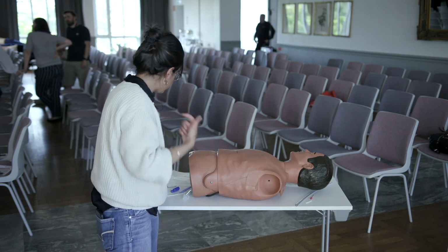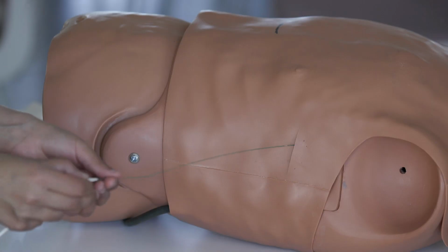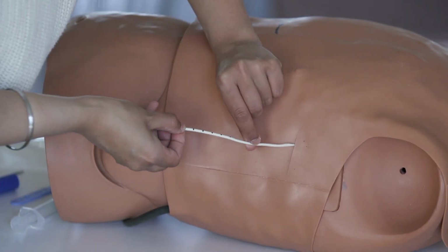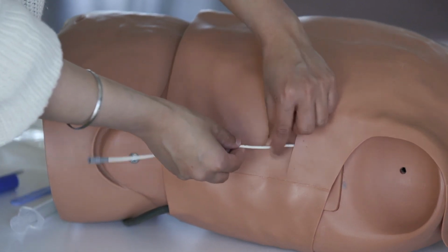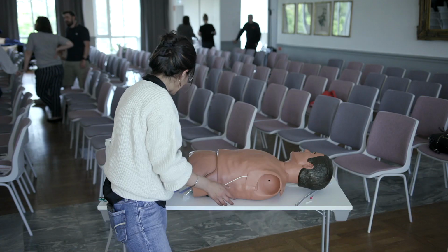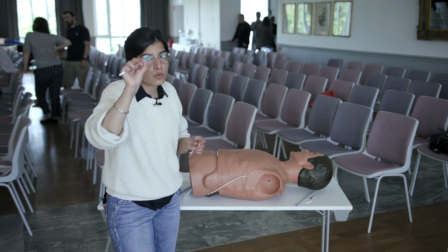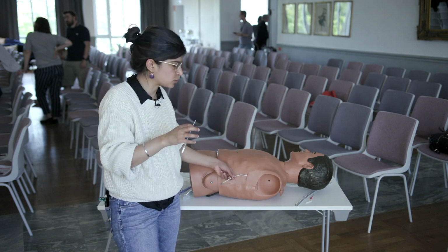Okay, so you've dilated enough, you come out, and because this is just flimsy enough, it just feeds right onto the end, just like a central line. And then you'll notice there are a couple of markings on the side, and a couple of really tiny fenestrations on the distal tip. You definitely want to make sure that all the fenestrations are in the pleura, but you don't always have to hub your pigtail. Depending on how far in you had to go with your dilator is kind of what mark you need to go to. Always give yourself some wiggle room though. Say you only needed this much of a dilator because your patient's super skinny, still push the drain in a little bit more, right? Because it's super flimsy and it can fall out.